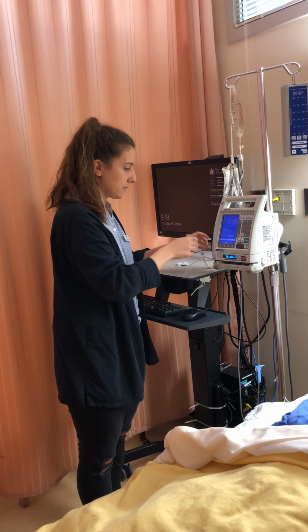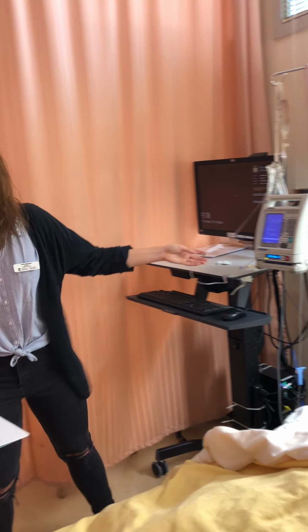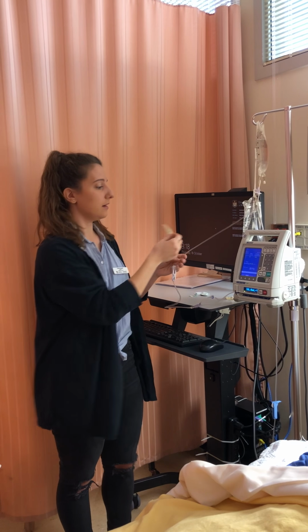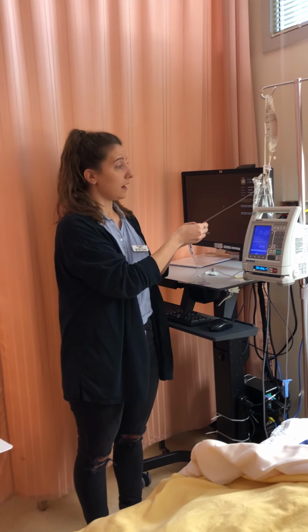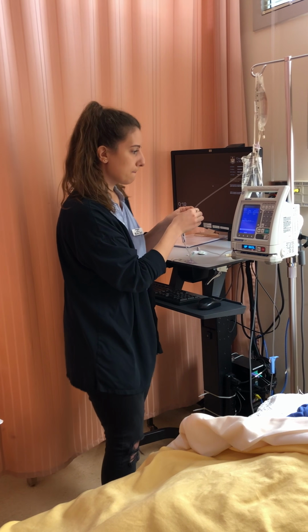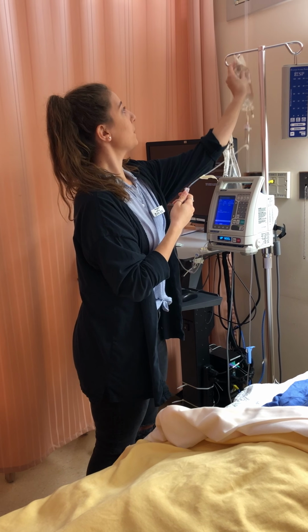This enters the patient so they get the correct dosage of medication. So I'm just going to back prime. Actually, I'm going to put my label onto my tubing, so I've documented when I hung this, just so future nurses know. It has my initials, the date, and the time. Call bell's in reach. So I'm going to back prime now.